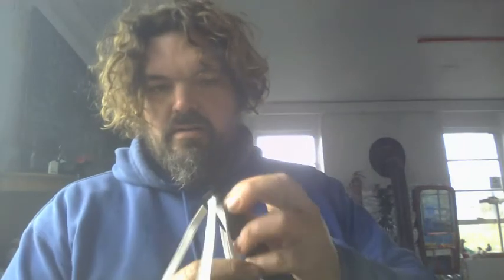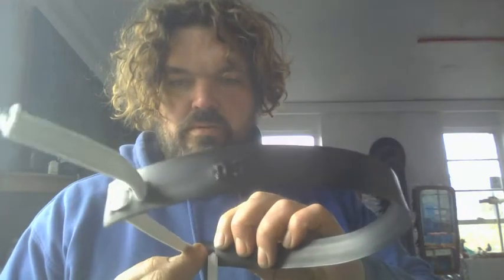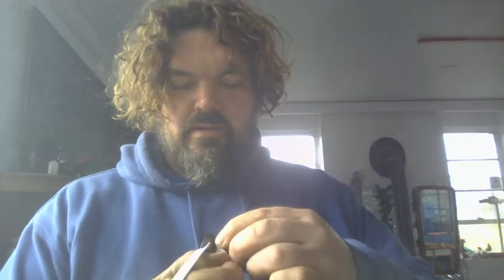On the other side, same rule. You don't want a lot of plastic. So, you enter from the inside and you go around. And here, against your skin, it's going to be the elastic again. I'll continue.